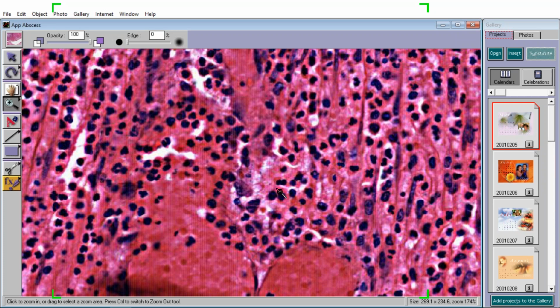Also, if they were lymphocytes, there would be very minimal cytoplasm, so it would almost look like these little round balls were almost right next to each other. Good. That's how the pathologist knows, even before going to high power, like we did here, that these are neutrophils. So what do you call neutrophils that infiltrate a tissue? You call it an acute inflammatory process because of the neutrophils. Now, we'll get to that a little bit later, but this is a classical acute appendicitis.